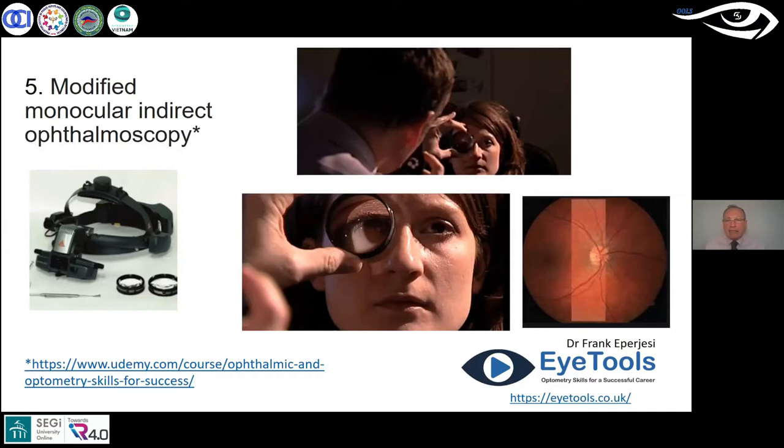I'm holding the lens in front of the dilated pupil and looking at the image that the lens creates. The lens creates an image between me and the lens — between the practitioner and the lens — and I'm looking at that image with a direct ophthalmoscope. I've got one here. I find this particularly useful on children.